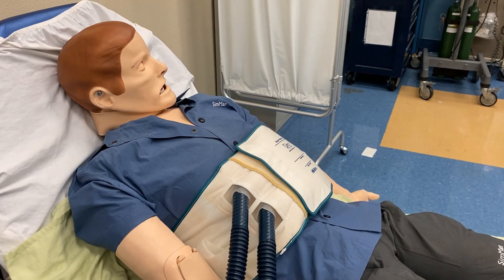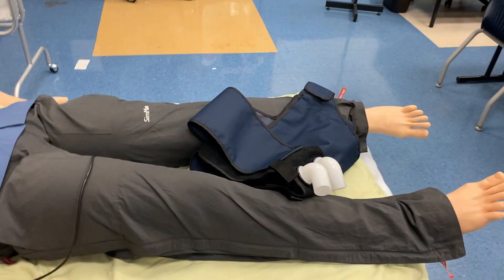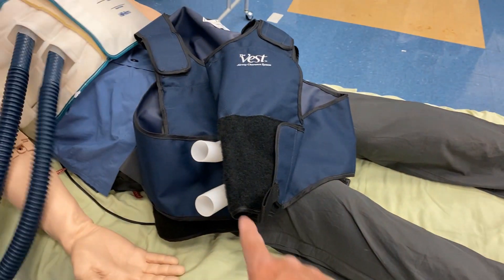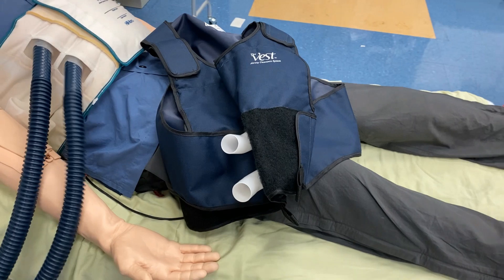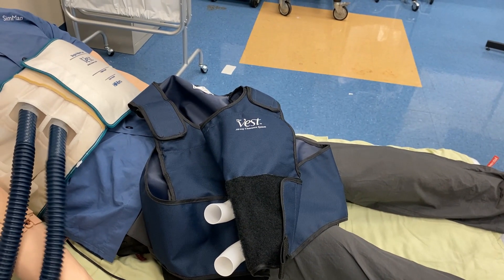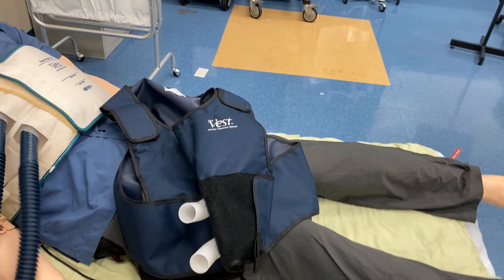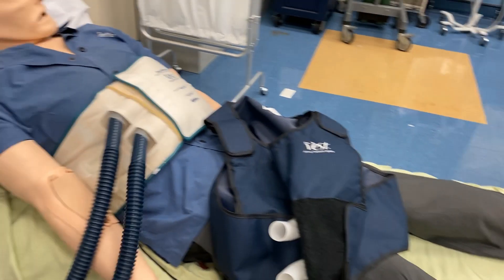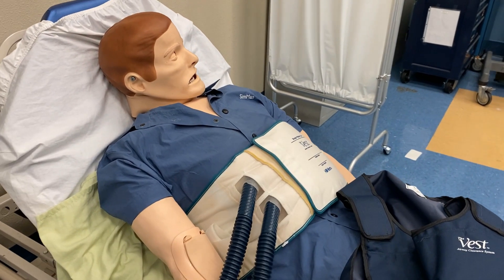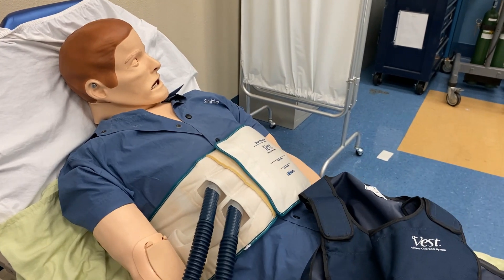You don't have to change the disposable vests unless they become soiled — otherwise you can use them throughout the stay. Here is an example of what the non-disposable vest looks like. They have connectors which the tubes fit into, are a little more comfortable, and because they have shoulder straps, the position of the vest stays more consistent. Patients with CF will actually stand while the vest is running, so that permanent non-disposable vest is better for patients moving around, versus the disposable vest, which is primarily for patients laying in bed. Put patients in a high Fowler's position, insert the vest through their back, bring it around, and do the Velcro connection.